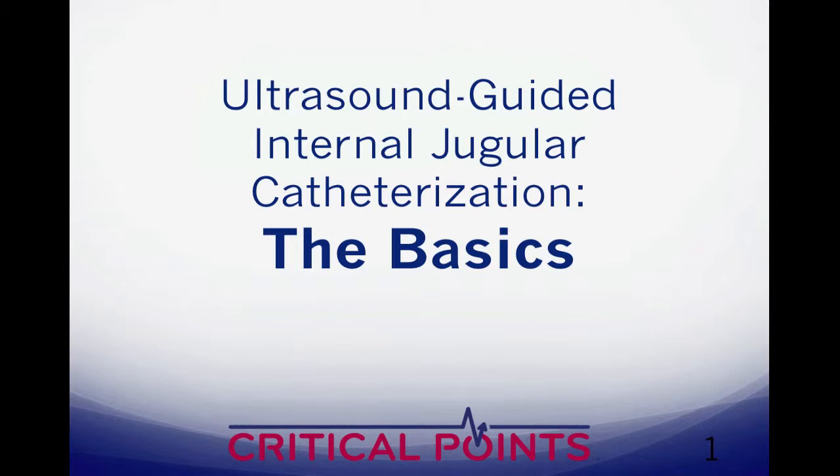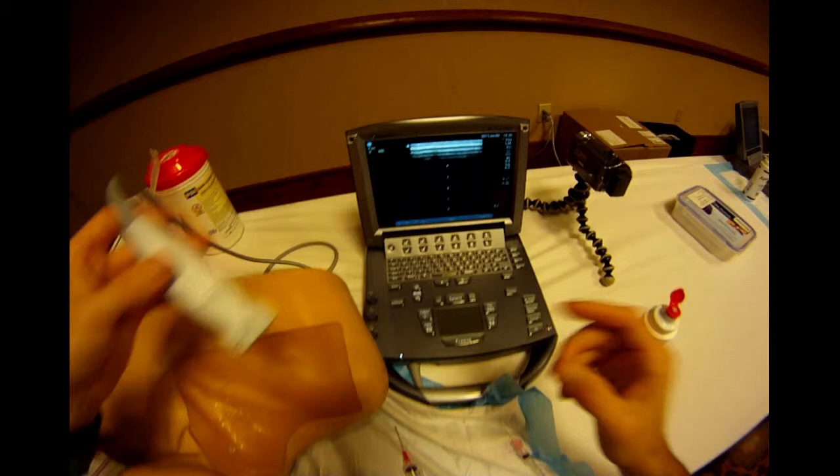I want to talk about ultrasound-guided IJ catheterization and cover the basics. I want to make you all expert in using ultrasound and putting in central lines, and the IJ is a great place to start. Some of the basics start with getting the probe orientation just right.